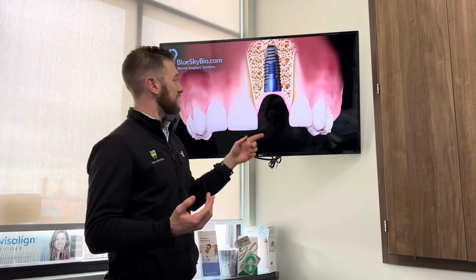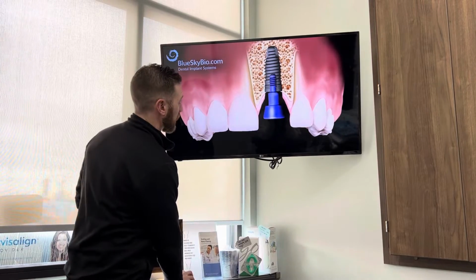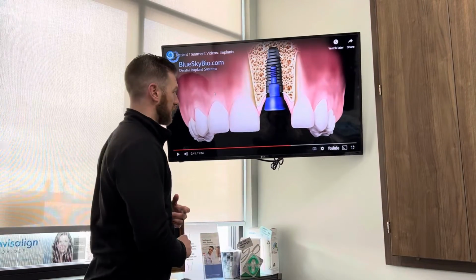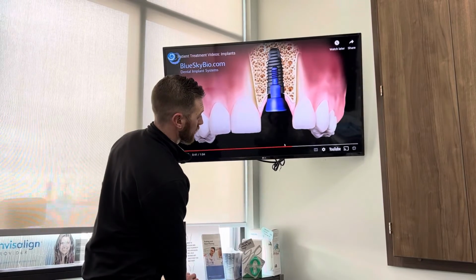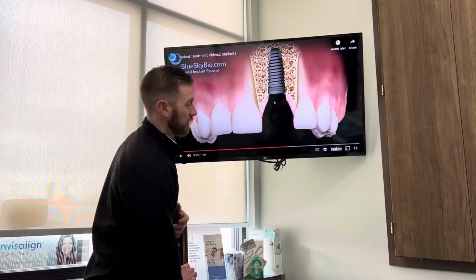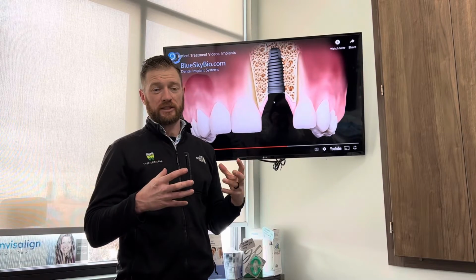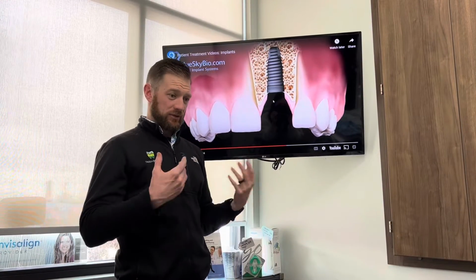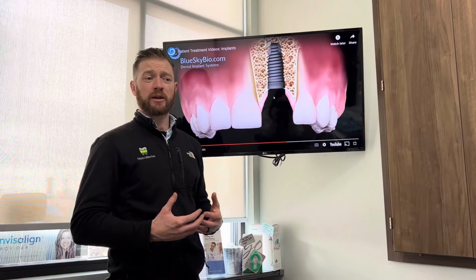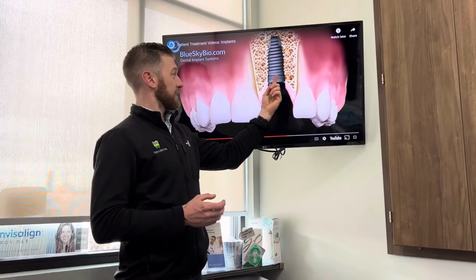So when you leave that day, you leave with a cover screw, and as this heals, you will not be able to actually see the implant through the gums. So at this stage, we wait 5 months, okay, to let your bone grow into those threads and make it really stable. That's called osseointegration. After that 5 months, you come in and we uncover the implant, which means we expose it so that we can get to this screw hole.